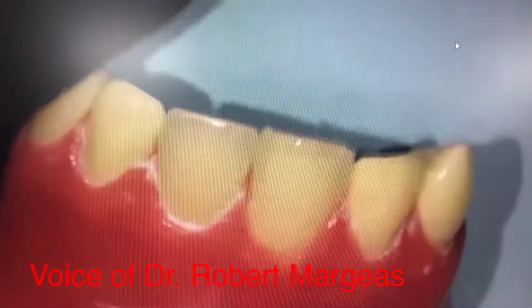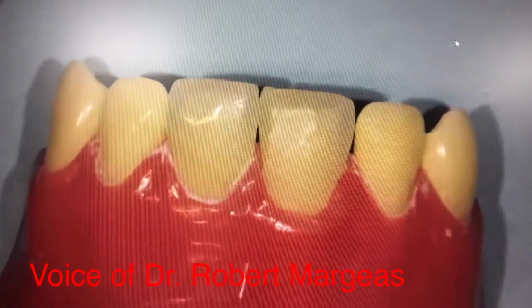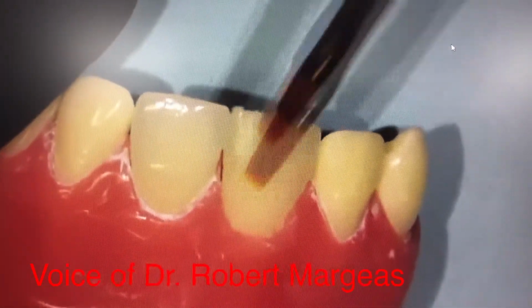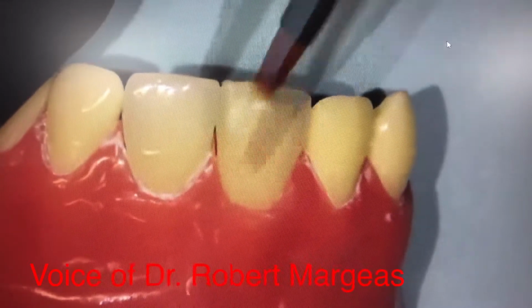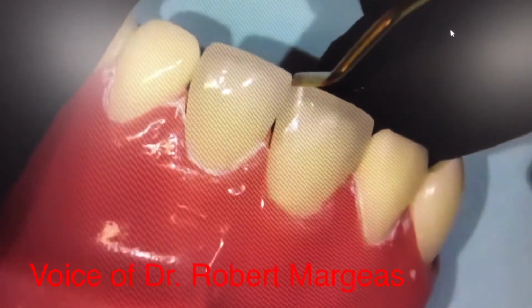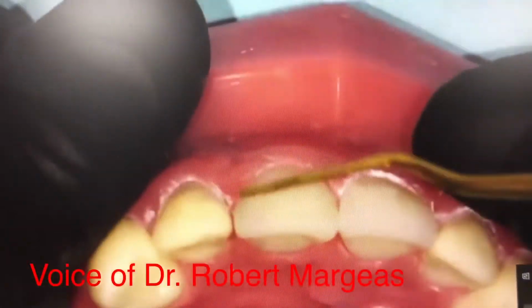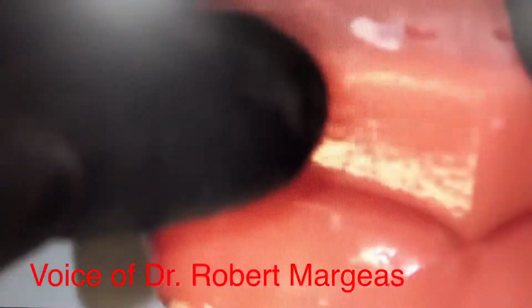Okay? You can see we're going to have a contact because I was able to pull that through. And if I want, I can take my brush, blend it in, and then cleave it off like this. Cleave it off. And from the incisal, you can see I have room still for my enamel. So you can see a little piece right here. What am I going to do? Push it in. And now I have room for a uniform enamel layer.